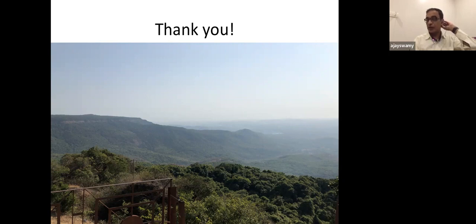This is different from a stalled burr. This might be a trapped burr, in which case there are a lot of problems that you have to encounter before getting it out, and that is a whole different discussion. In that case, I would actually do a very, very slow peck. The fast peck is where people just touch and come back, touch and come back.